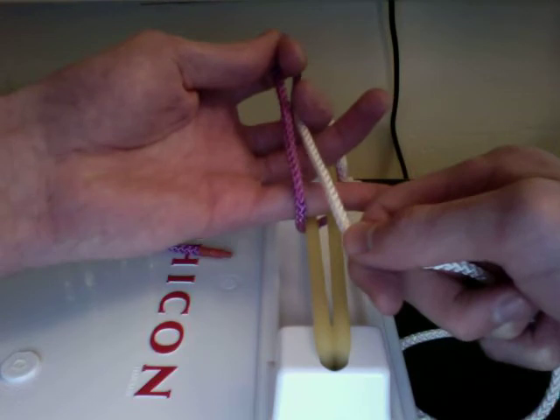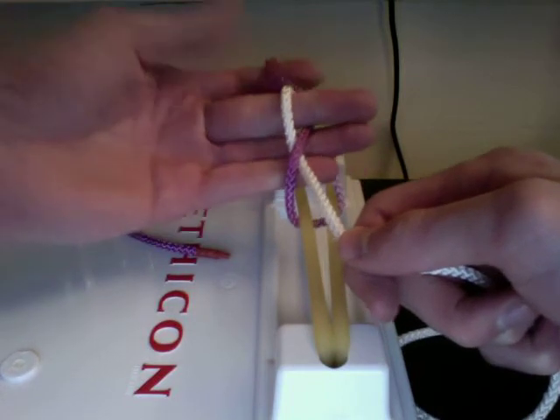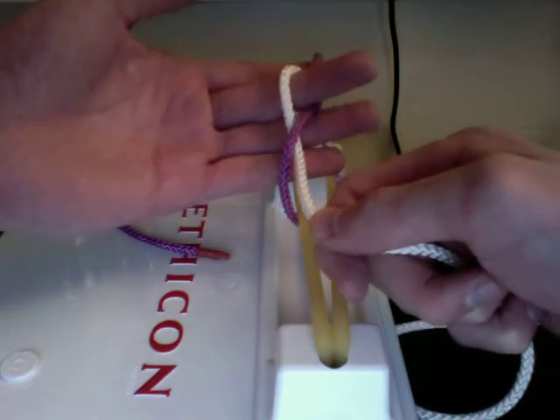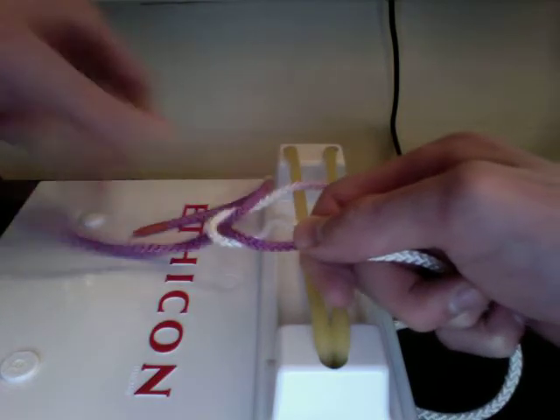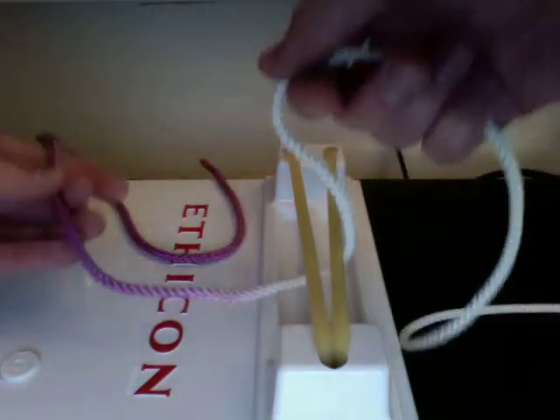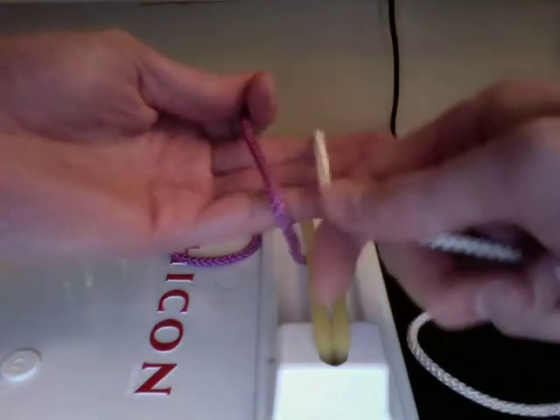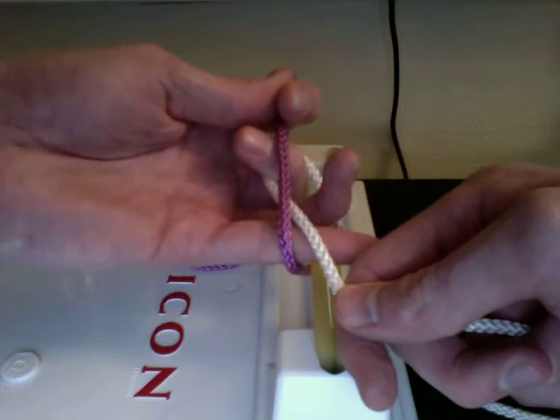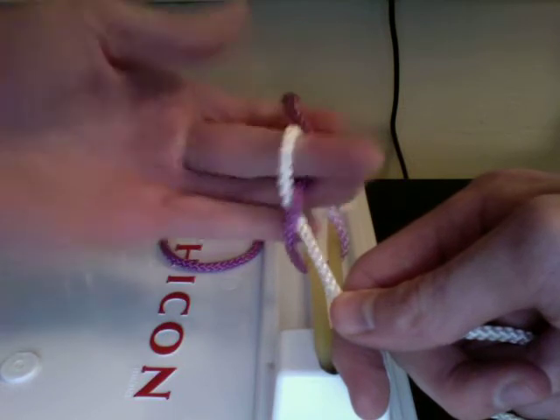This is the tricky part: you're going to curl your middle finger so that it goes over the white and under the purple. Then you're going to straighten out your finger and pinch the purple with your middle finger and your fourth finger, and use that to pull it through the little white loop. I'll do that one more time — purple away from you, white coming towards you, curling your finger so the white is under the tip and the purple is over the tip, straighten, pinch, and pull through.